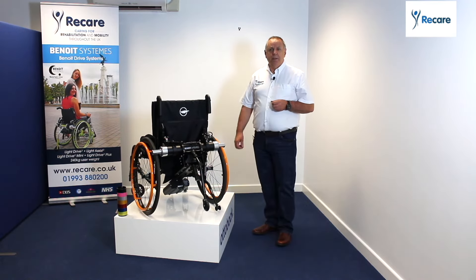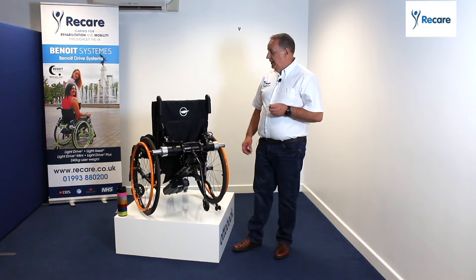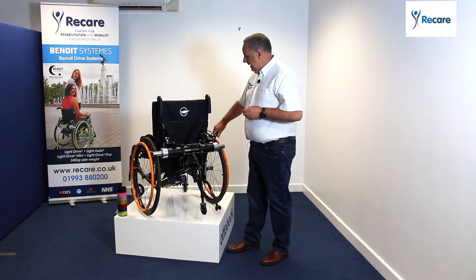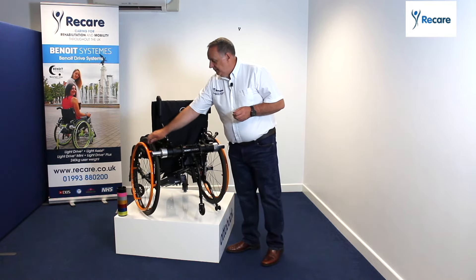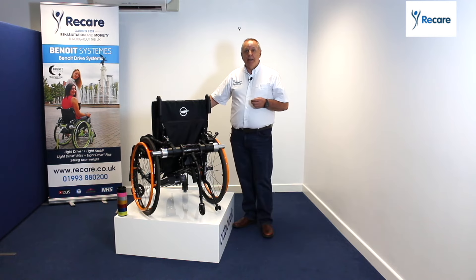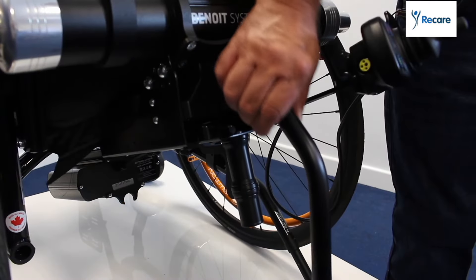What does that mean for you? It means if you're out and about, you've got the flexibility to change your manual chair into a power chair. What you do is you literally engage the two levers and you've now got a power chair. So that means you can independently go up and down those slopes, cross the grass, and continue to drive throughout the day, which increases your journey and your independence and mobility.